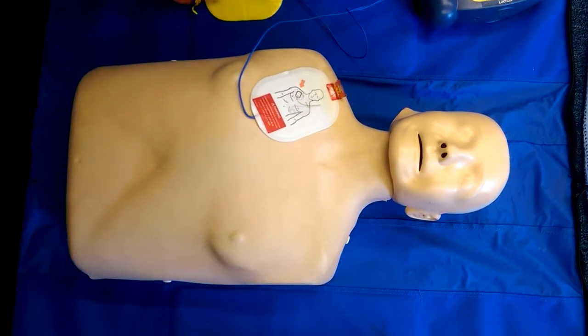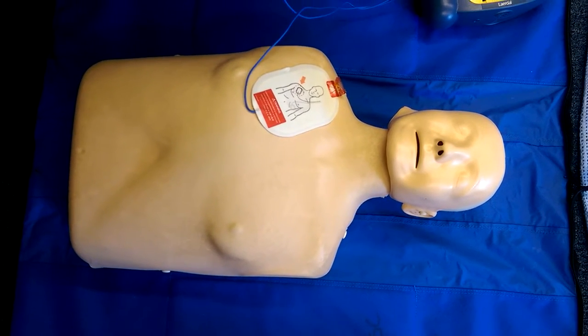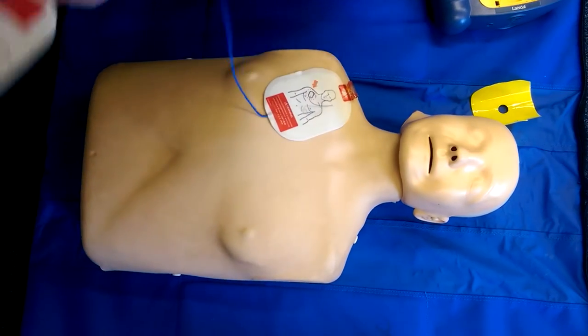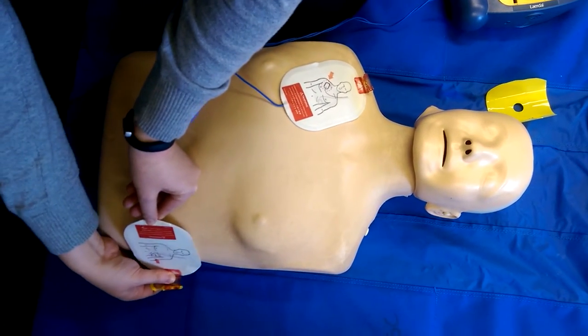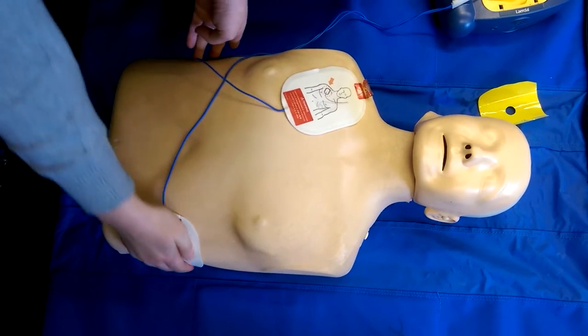That first pad is attached. Now we're going to do the second one. This is going to allow a line of current to go through the heart. The device says: 'Look carefully at the picture on the second pad. Peel the second pad from the yellow plastic liner.' And there we go.